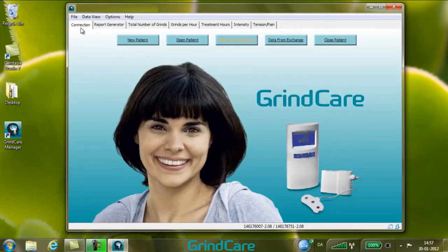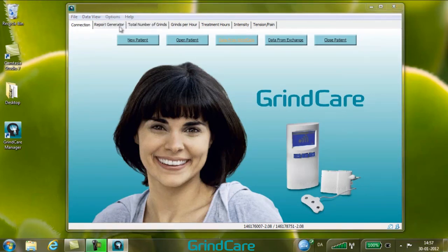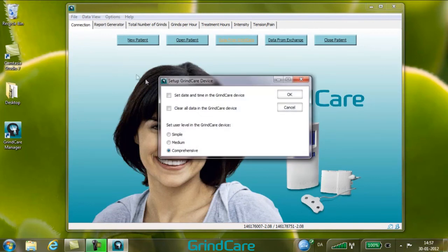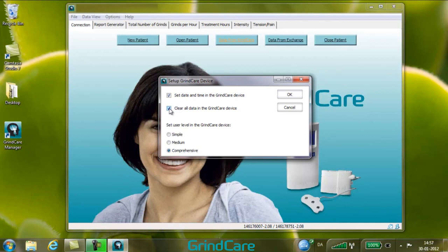From GrindCare Manager, you can configure some of the basic features of the connected GrindCare device. Open the Setup menu in the Options menu. You can configure the following parameters: set the date and time in the GrindCare device — by checking this box, the time and date in GrindCare will be set to the time and date in the computer. You can also clear all data in the GrindCare device — by checking this box, all data including the calibration in the connected GrindCare instrument will be deleted.